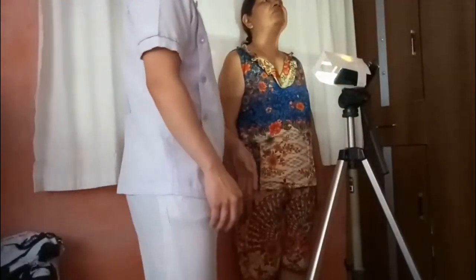AP axial projection. Place the patient in the supine or upright position with the back against the IR holder. Adjust the patient's shoulders to lie in the same horizontal plane to prevent rotation. Center the mid-sagittal plane of the patient's body to the midline of the table or vertical grid device. Extend the chin enough so that the occlusal plane is perpendicular to the tabletop. This prevents superimposition of the mandible on the mid-cervical vertebrae.